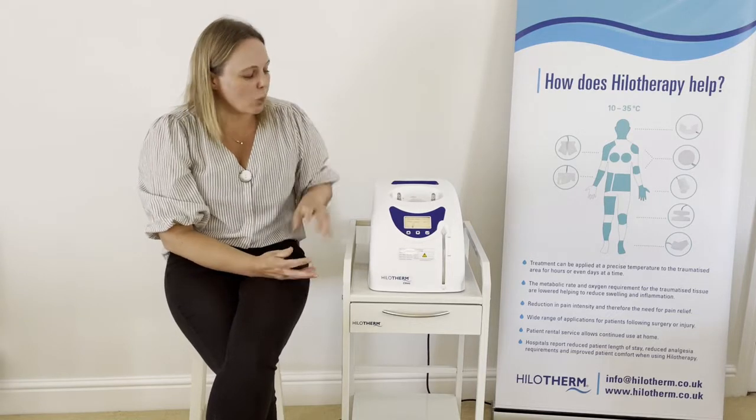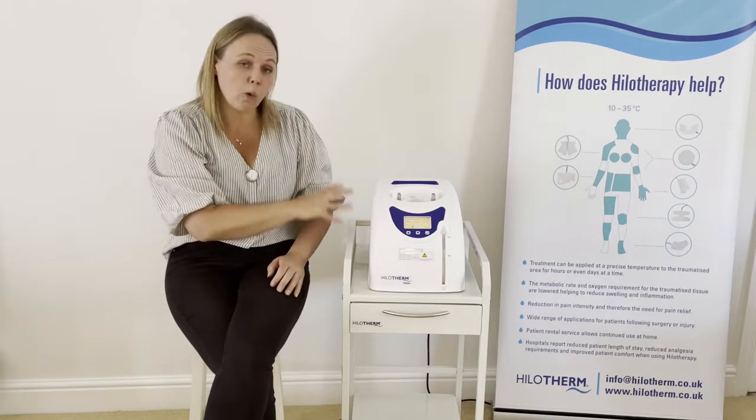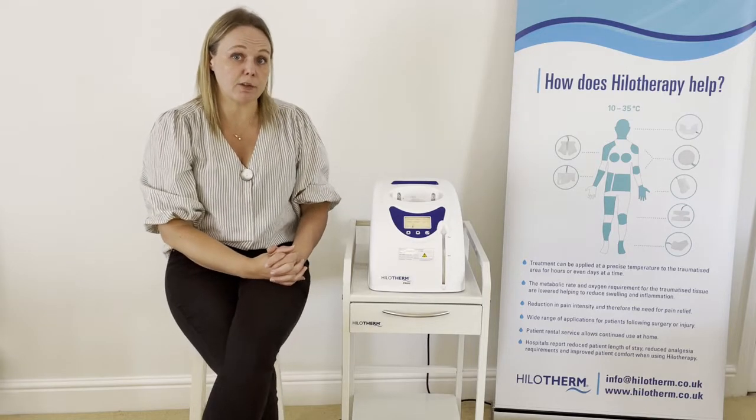One of the other things that can impact on the actual temperature is the environmental temperature. If the room is particularly hot, that will impact on the device's ability to cool, so we recommend a room temperature of 23 degrees C or below.